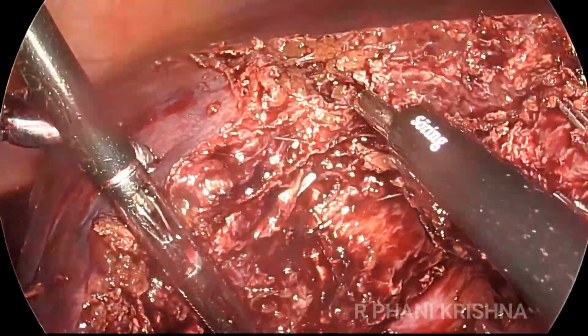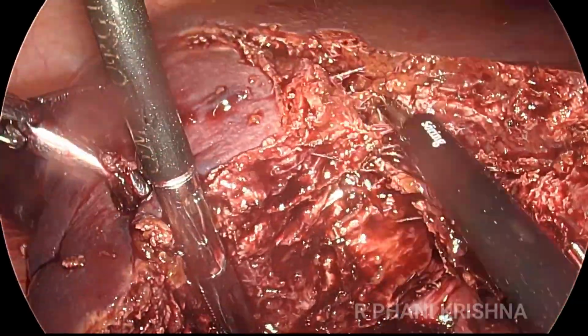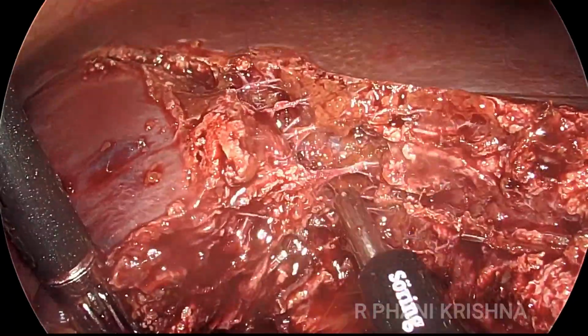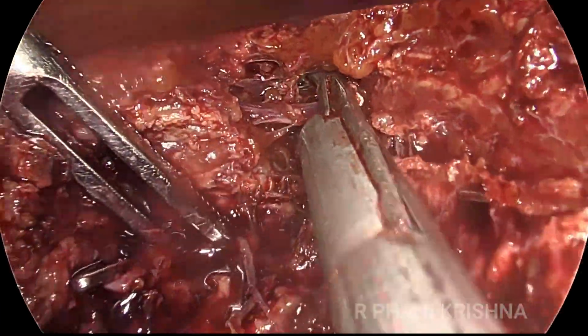This is an 8 French Foley's. This is being tightened, so it gives effective Pringles without any need for any extra port or an extra instrument, and also nothing comes in our way during the dissection.